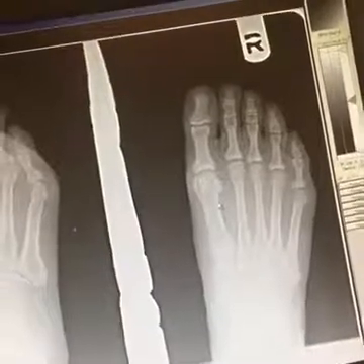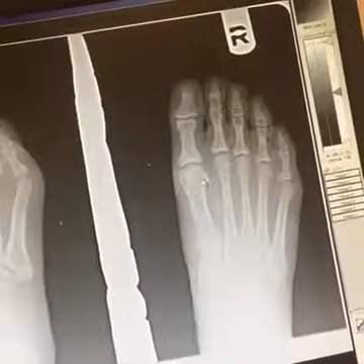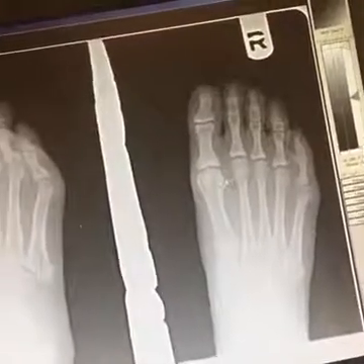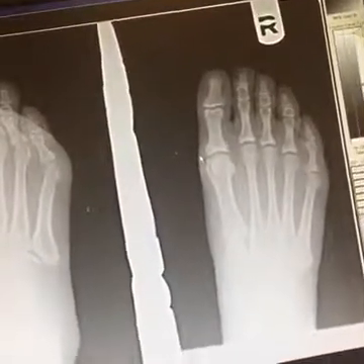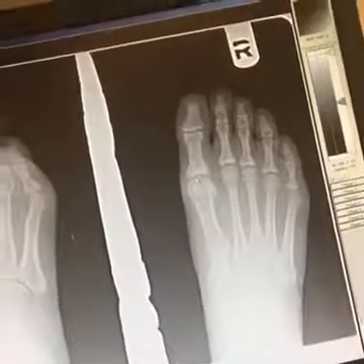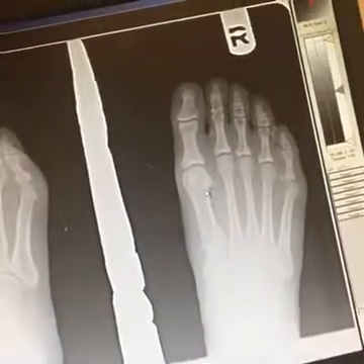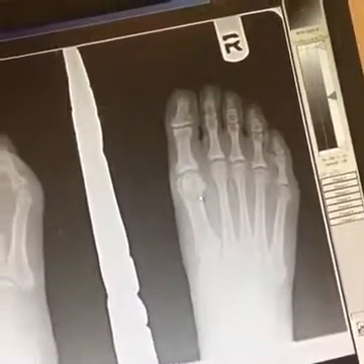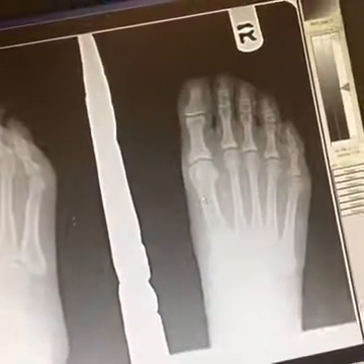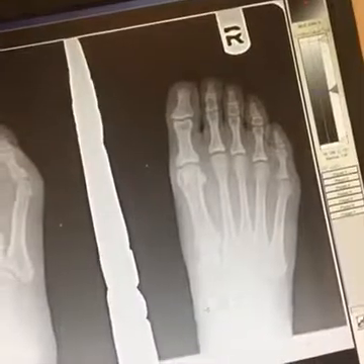Looking here, we see the sesamoids — two bones underneath your first metatarsal head that lie within the tendon of your flexor hallucis brevis. Just like your kneecap or patella, the purpose of the sesamoids is to help transmit forces. Without sesamoids, we would not be able to ambulate and transfer that amount of force through the first MPJ. The flexor hallucis brevis retracts and pulls the sesamoids back when you push off, so you're not rolling over them. If you throw off the timing of push-off at the first MPJ and don't get those sesamoids out of the way, that is how you can get sesamoiditis and sesamoid fractures.